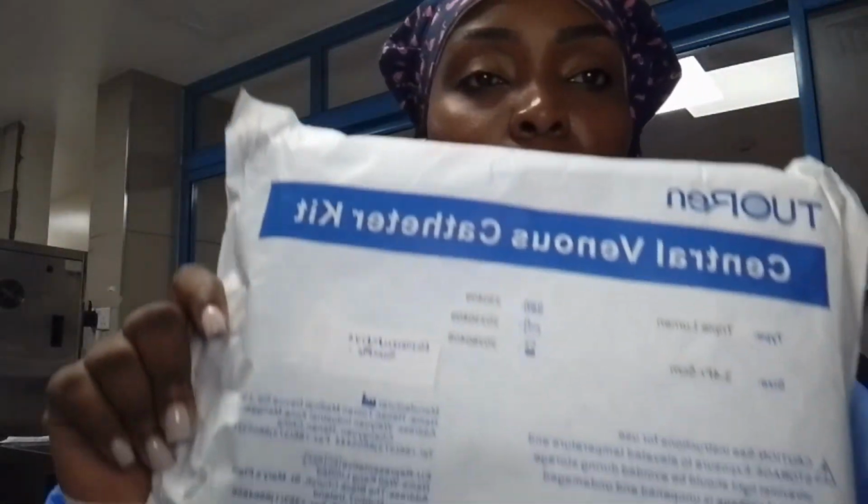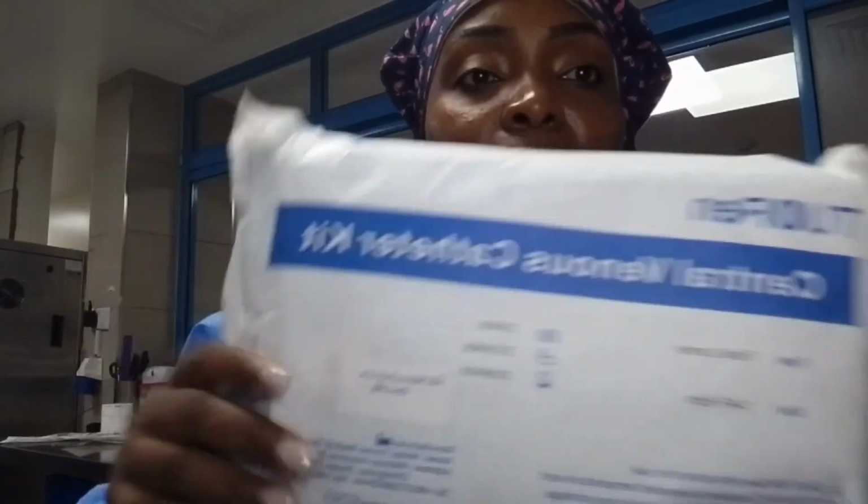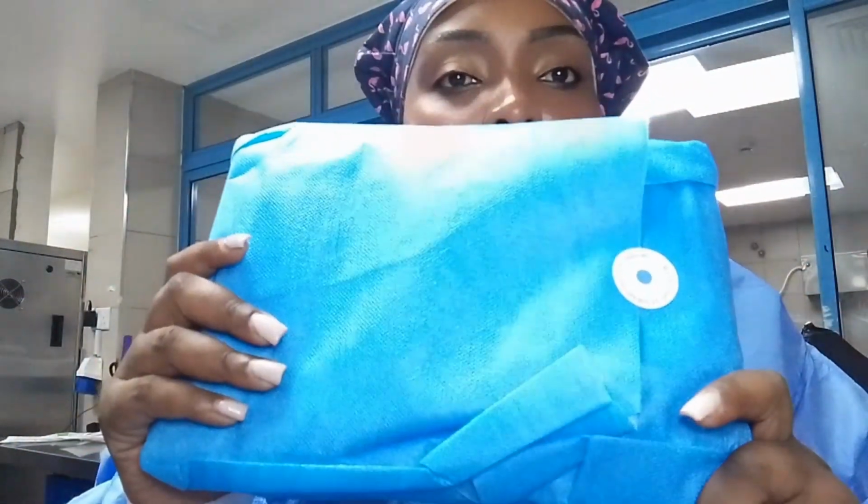Now, after that, we will open our central line kit. First things first, you must ensure your kit is intact and not expired. Okay, I don't know why the screen is dark. Your kit is not expired. This is how it looks. I will open it. This is for educational purpose only.